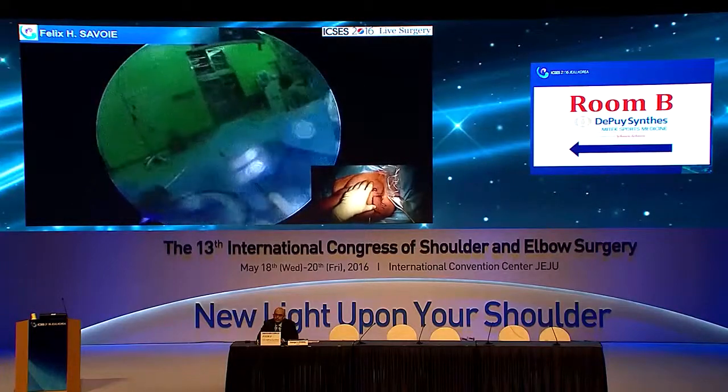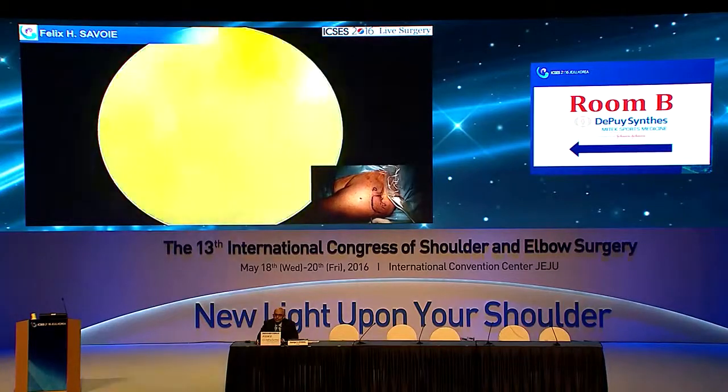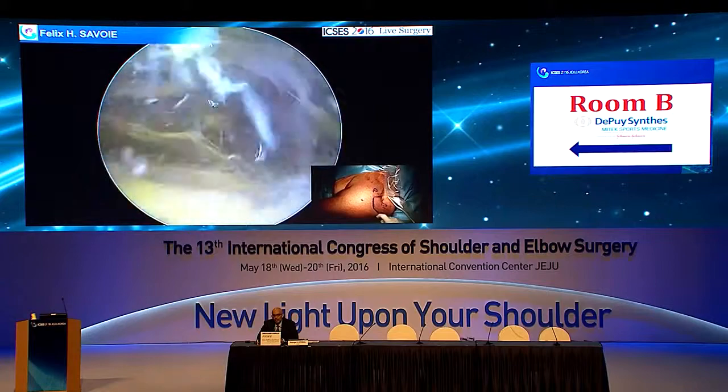Sorry, I had to reach back a little bit. And so I just kind of sweep in. I go lateral more than medial. I think it's always a risk if you go too medial that you'll get into the rotator cuff. And so I'd rather be out over here.